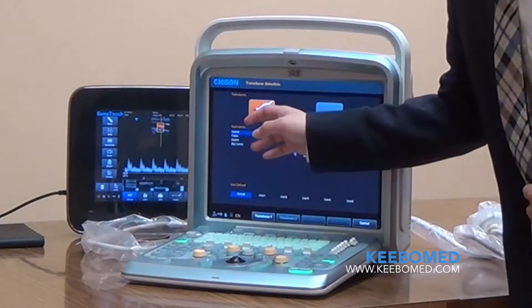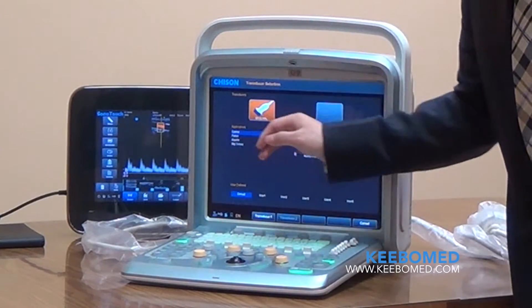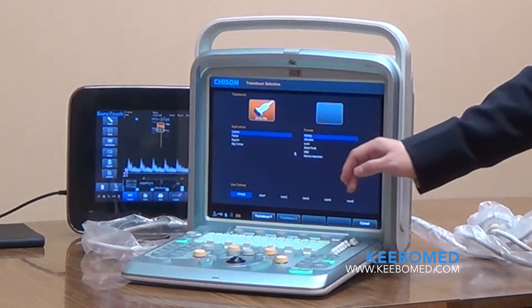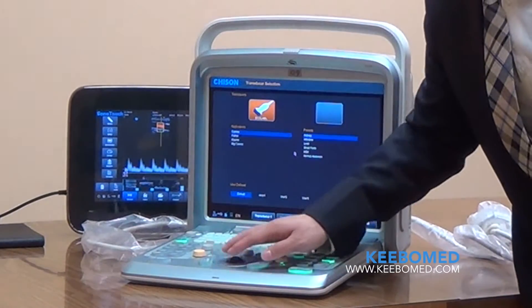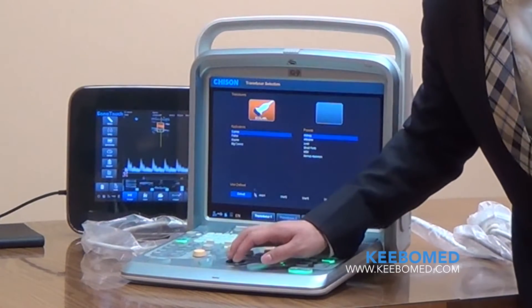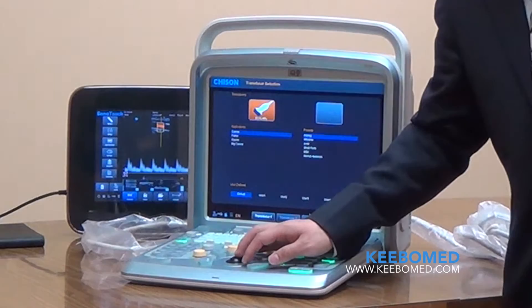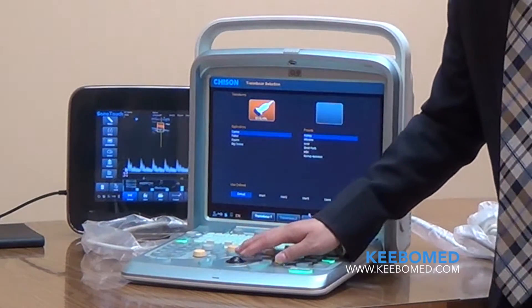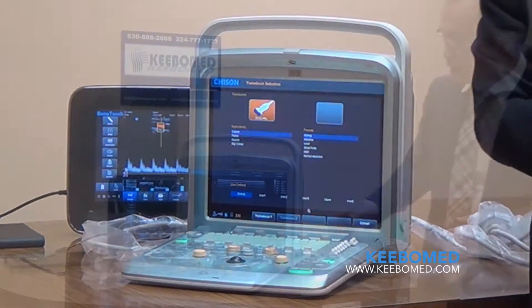For example, this system has different applications and different presets. For each preset, we also have user-defined presets — five user-defined presets. So that means it can be used by five different doctors.